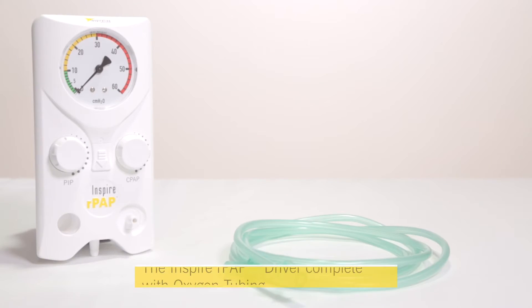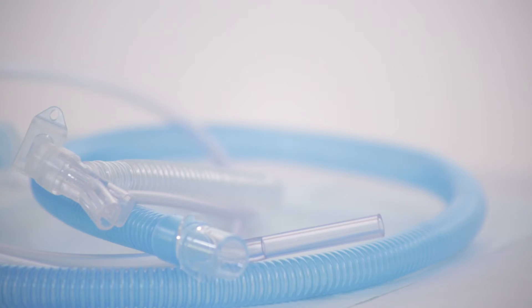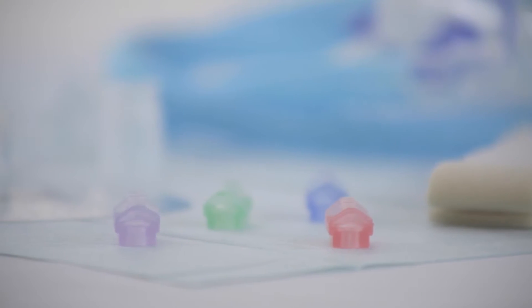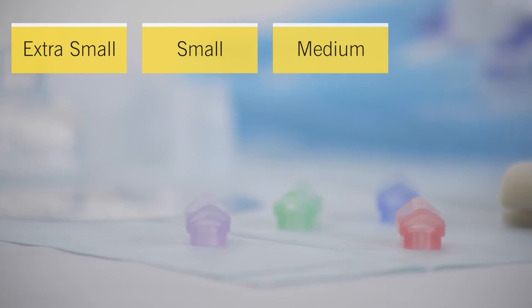The Inspire RPAP driver, complete with oxygen tubing. The Inspire RPAP generator and resuscitation circuit. A nasal prong adapter with nasal prongs and a nasal prong sizer. The nasal prongs are colour coded and come in four sizes: extra small, small, medium, and large.